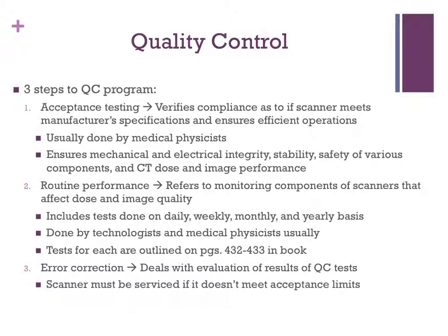The ACR and International Atomic Energy Agency have specific tests that they suggest be done by the CT techs and specific tests that should be performed solely by the physicist. Take a quick look at these specific tests on pages 432 and 433 of your book.